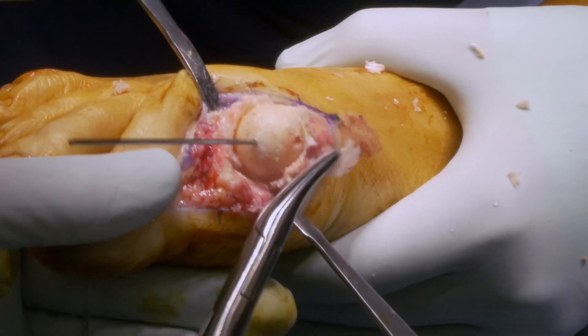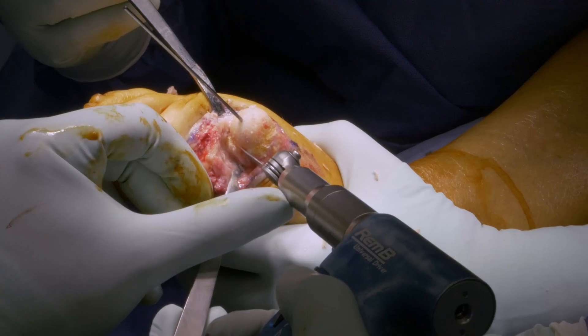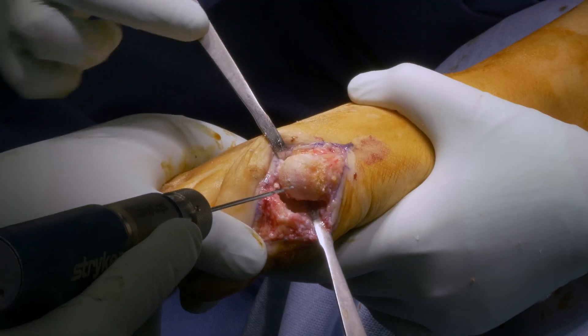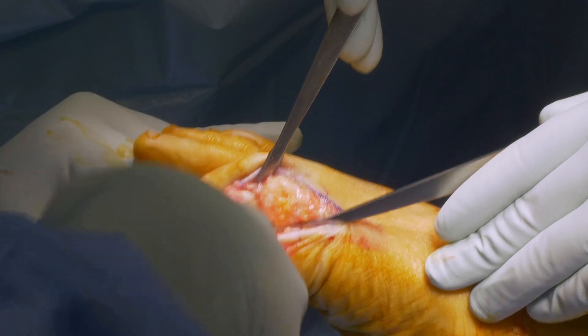Remove the remaining bone. Additional bone is removed intracapsularly on the plantar side to prevent impingement with the underlying sesamoids. Micro-drilling should be performed on the metatarsal head for better fusion of the joint with a small drill bit.